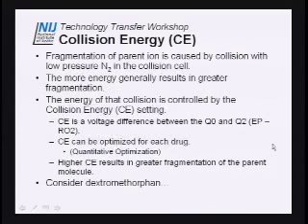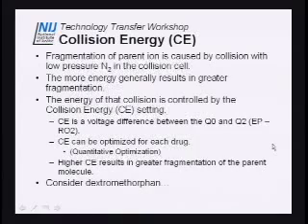No, not really. The energy of that collision is controlled by the collision energy setting, which is CE. It's really the difference between Q2, which is the potential on those rods, and the voltage on Q0. So you can see how EP, entrance potential, again, is related to every other voltage in the instrument. And it can be optimized for each drug, and that's called quantitative optimization. That's something you guys got to do yesterday. Higher collision energies result in greater fragmentation of the parent molecule. And I want you to consider the example of dextromethorphan. Now, yes?